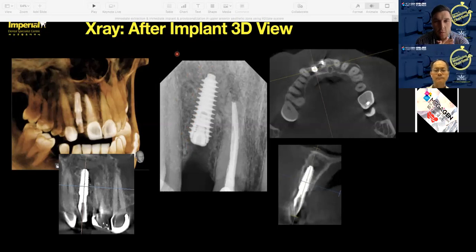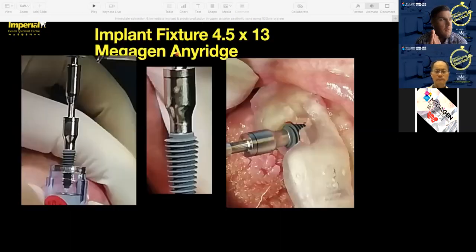And the second would be, does it make any difficulty for you or maybe even for the patient? When you were talking about the thickness of the guide, the thicker the guide, the more precise it is. But when we're talking about the anterior region, no problems with that. But when we're talking about the posterior region, the thicker the guide, that means the patient has to open his mouth more widely. Am I correct with that?